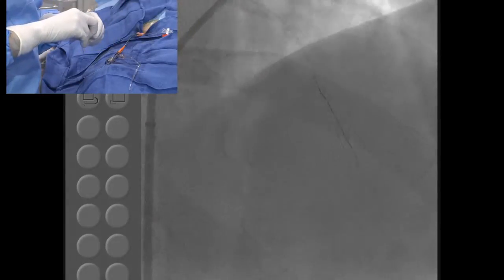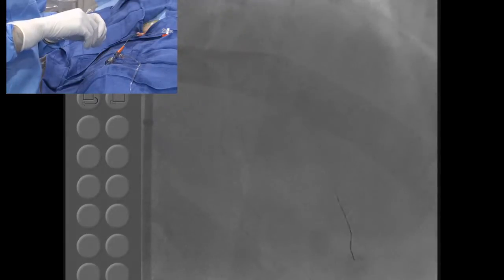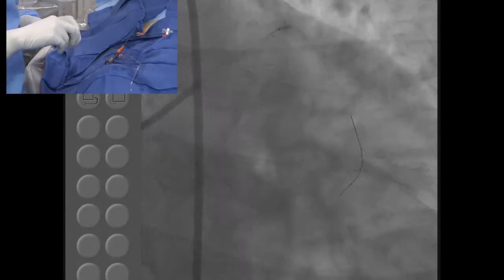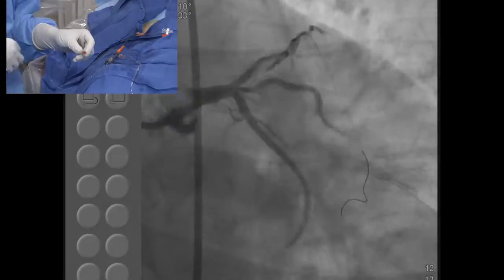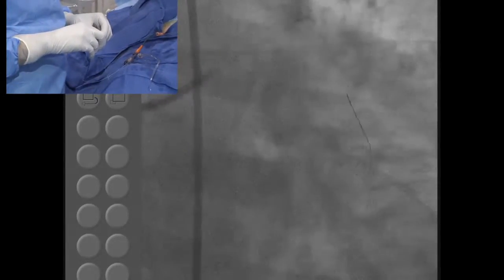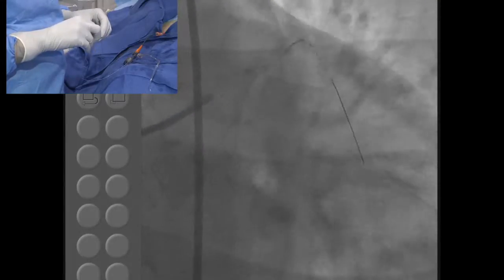Here maybe, I think you need a confianza. I'll try to see if I can get in some dye. And there it looks a little... No, let's go to the caudal view. That's the only way you'll know. Okay, now you want to take a cine? Cine, yep. Maybe we are in a small apical. Okay, let's bring the fine cross a little further, and at this level, we need to move. I think at this level we may re-puncture with the confianza, unless there's another CTO in the apex.